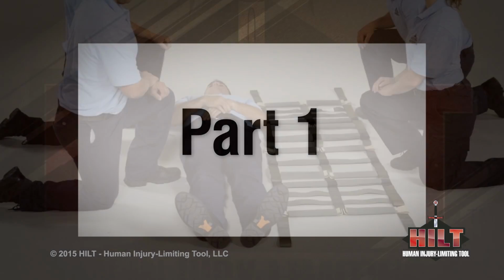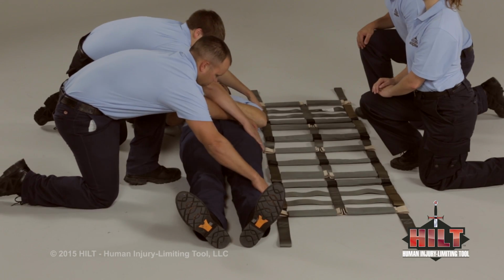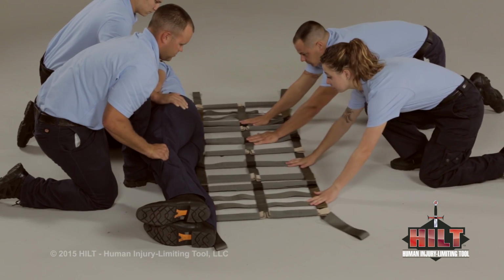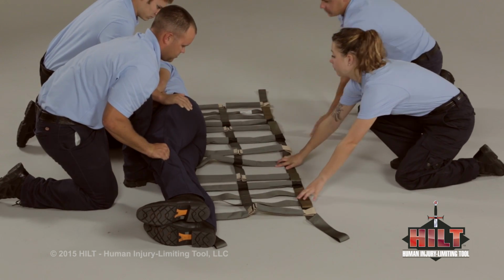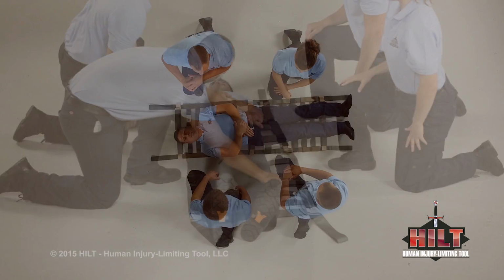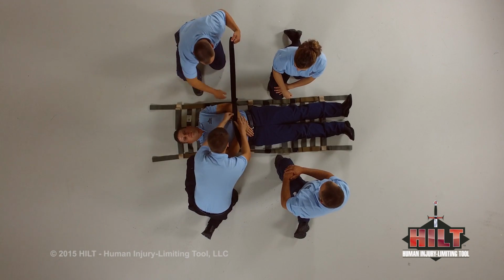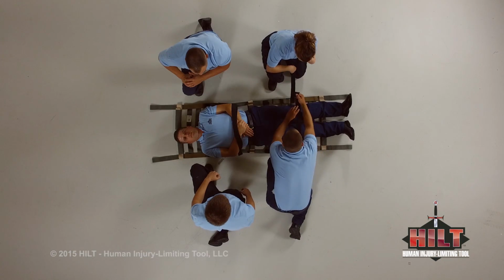Part 1. To load a patient onto a full-length HILT, deploy the HILT next to the patient. Log roll the patient and slide the HILT over. Log roll back and center the patient. If desired, deploy safety straps and fasten them around the patient's upper and lower body.